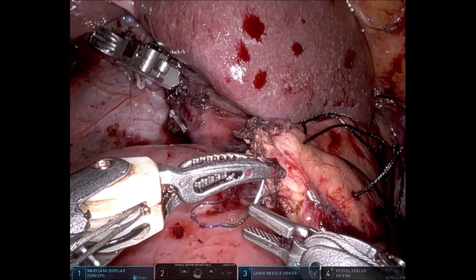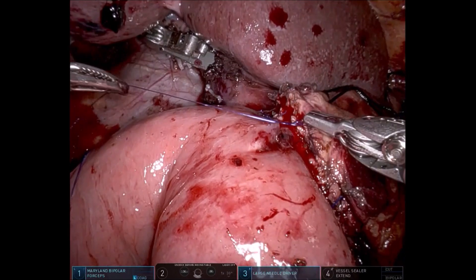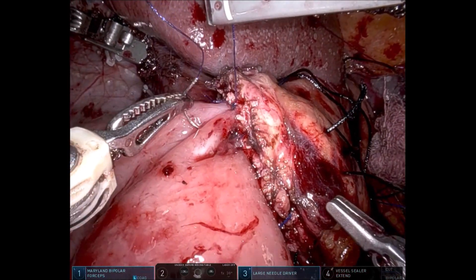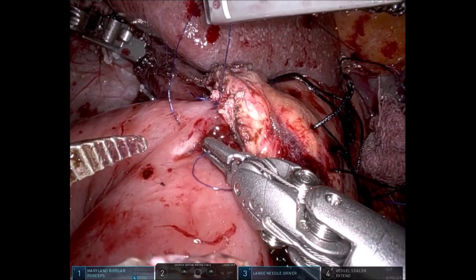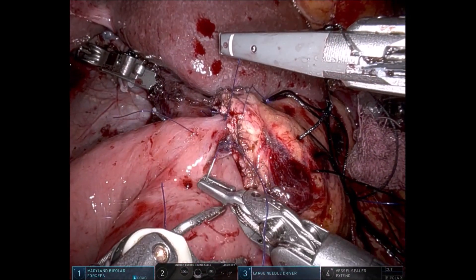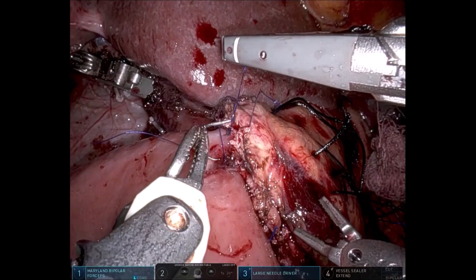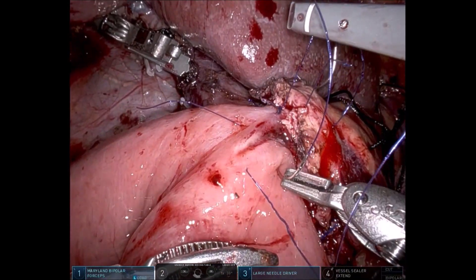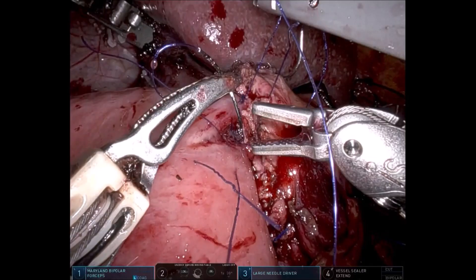We take an 11 o'clock suture, out-in of the jejunum and in-out of the pancreas. Seeing that only a small 2 mm opening remains, we take interrupted sutures with stay. The 11 to 12 o'clock position suture is placed out-in of jejunum and in-out of pancreas, left untied to allow subsequent sutures to be taken under vision. The next suture is placed at 1 to 2 o'clock, and then at 3 o'clock — out-in of jejunum — ensuring precise duct purchase.